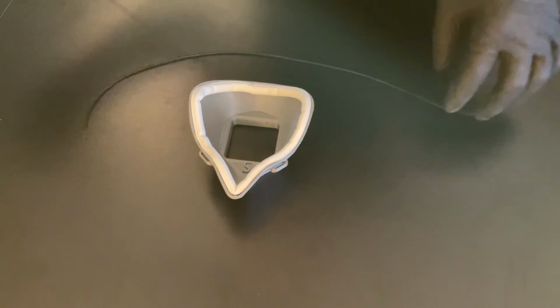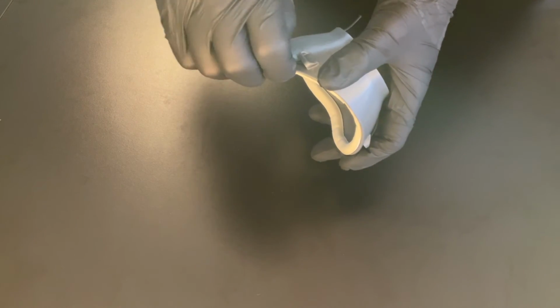Connecting the ear bands. Using 2 elastic ear bands for each mask, slip the unknotted side of the pre-cut elastic ear band into each of the top slots on the mask, pulling through the elastic until it locks into place. Then, slip the other side of the unknotted elastic into the bottom holes from the front side of the mask.